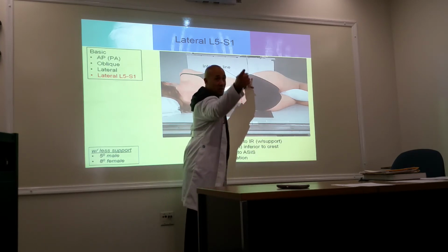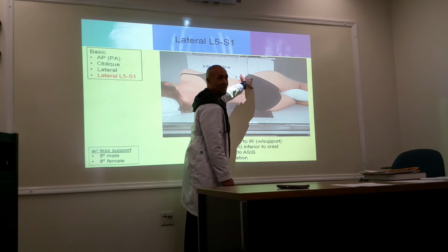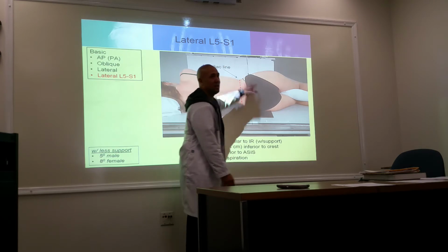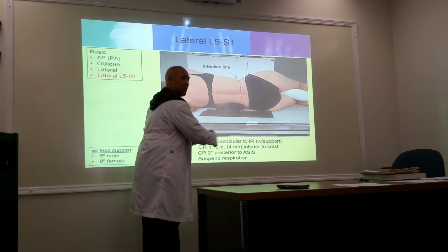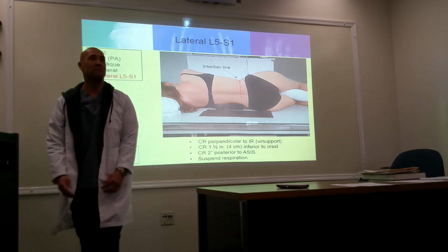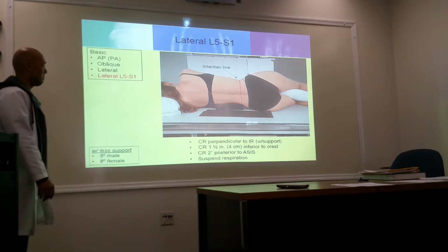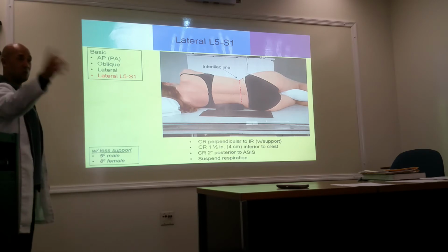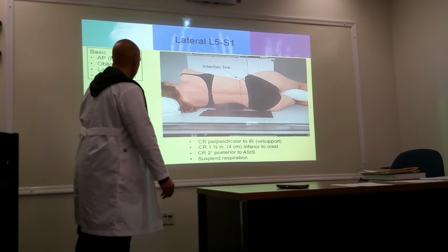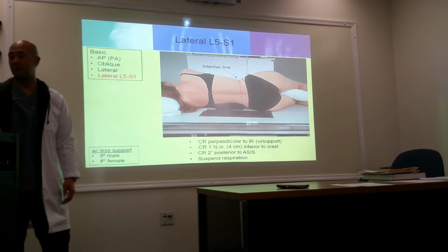That's too hard. That's how you guys do it. There's an intern that does it like that. There are several ways to do it, I think there's like 7 or 8. What I did was I just went 1.5 inches down and pushed my patient forward about an inch, inch and a half, and I hit it every time. But you do as they do, and then you come up with your own technique of how to do it, as long as you can get that L5-S1 in the middle of your image.